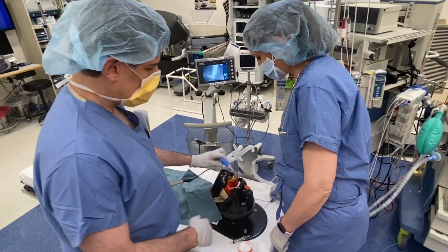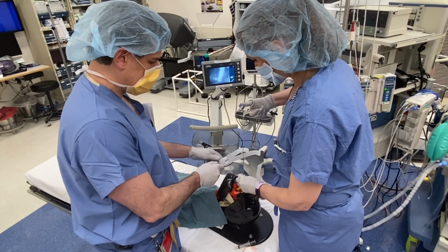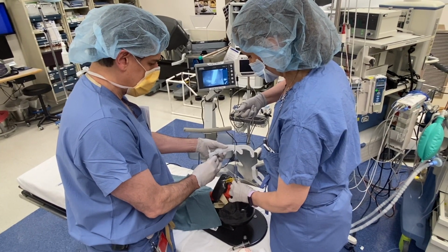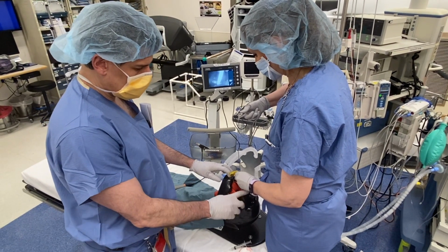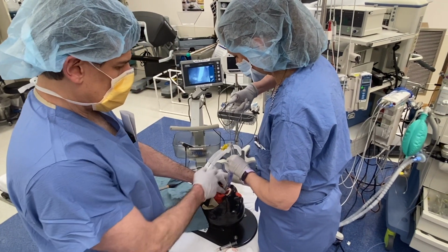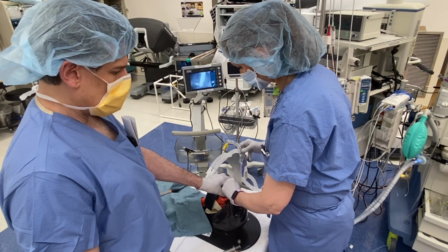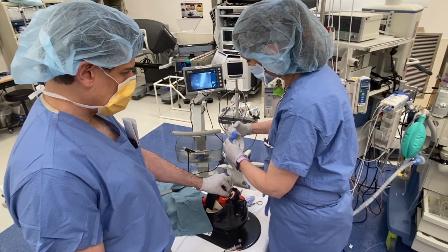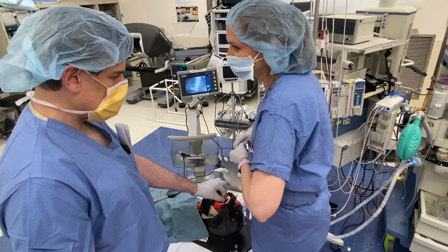Okay, so now Bistra is going to disconnect from the ventilator, including the connection pieces, and she's going to stabilize the ET tube and slowly pull out the laryngeal airway. As she does that, Pete is going to grab the tube as soon as it appears in the mouth, and then Bistra removes the laryngeal forceps or the pushing device, stabilizing device, because it's possible to get the pilot balloon stuck beside it. So you need to remove your stabilizing device before you take out the tube.